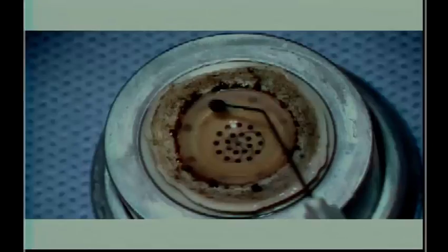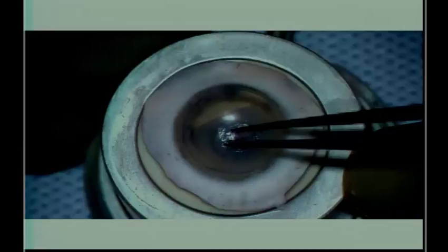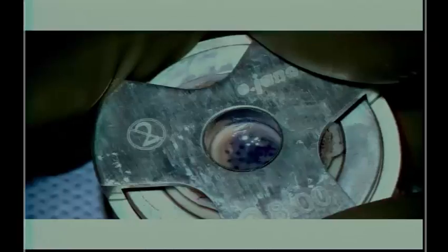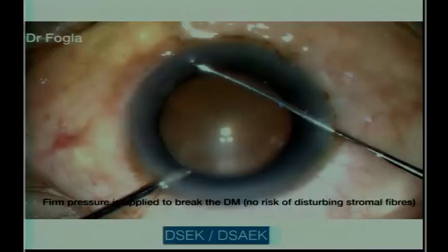There are several techniques, and if you try and master one of them, that would be great. I use a 10 millimeter trephine, which is 100 microns, so it's a partial depth trephine. You do a 10 millimeter partial trephination, mark the edges with trypan blue, then use a forceps to partially peel, about a 70% peel. Then you use a 3 millimeter or 2 millimeter trephine to punch out a stromal window, mark the stromal side of the Descemet, then go back and do an 8 millimeter central donor preparation. You can peel off the Descemet, and this technique of marking has been from Mark Terry's group, and I think that's really useful. And then we use the trypan blue staining, as you saw.